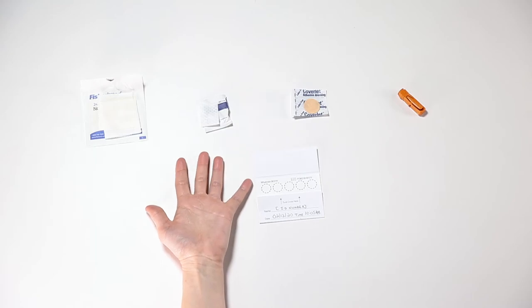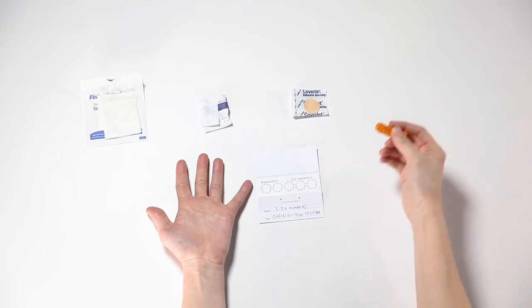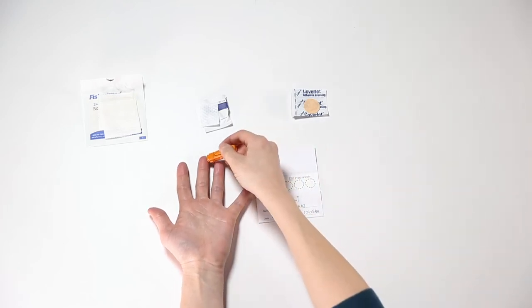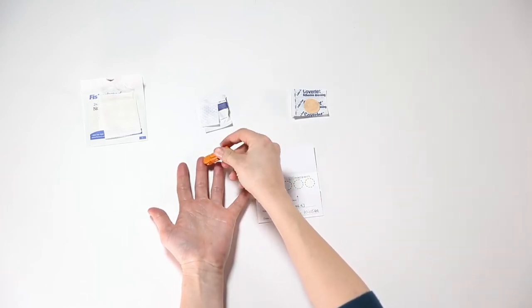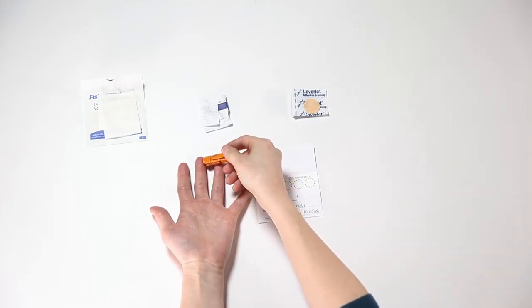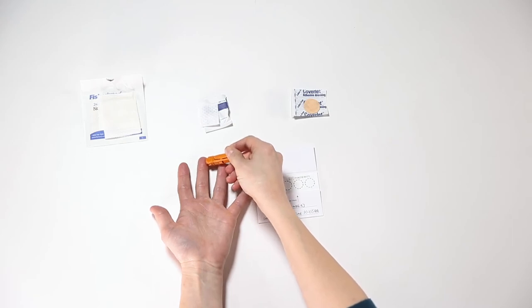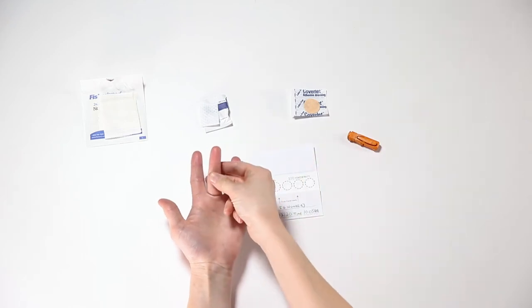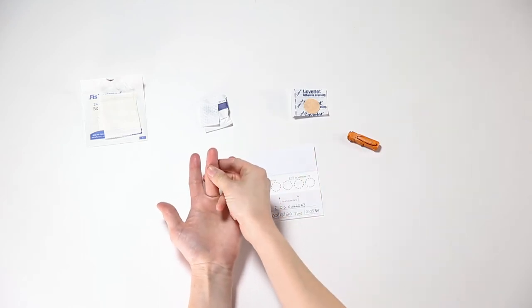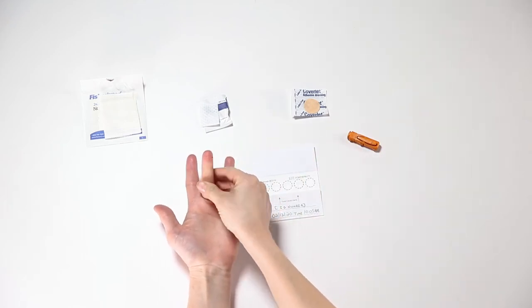Lay your hand on a table, palm facing up. Position the lancet so that it rests on the side of a clean finger. Never use the tip or center of the finger. With firm pressure on the finger, activate the lancet by clicking the button on the side. You will feel a prick when the lancet has been activated.